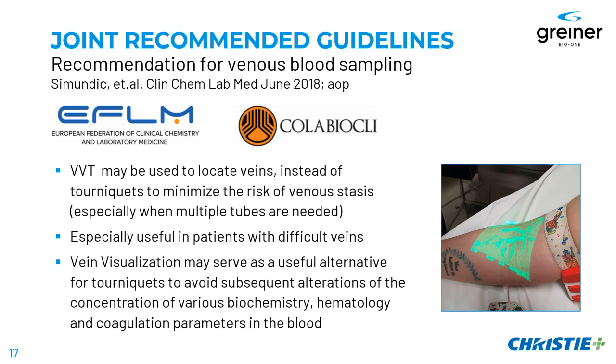These guidelines are always rooted in evidence. These bodies, their entire job is to study the research and make best practice guidelines for what we should be doing out in the real world. So guidelines should not be taken lightly. This, again, isn't somebody's opinion at the hospital down the street. This is based in multiple people's research and work and what their outcomes have been.